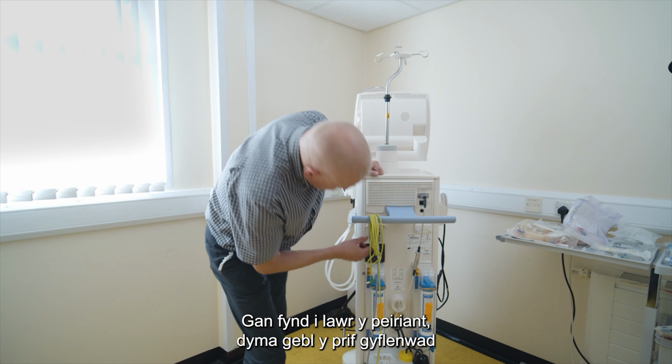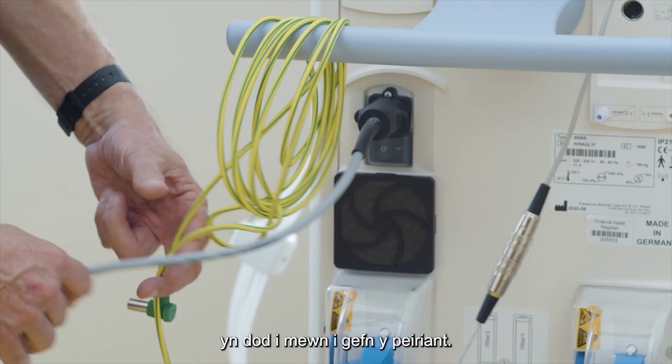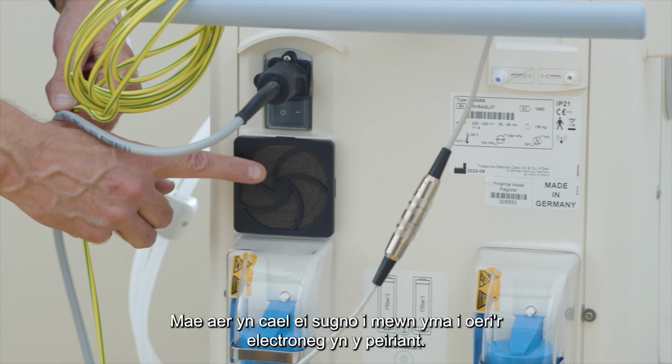Going down the machine, this is the mains cable coming into the back of the machine. This is the cooling fan. Air is sucked in here to cool the electronics within the machine.